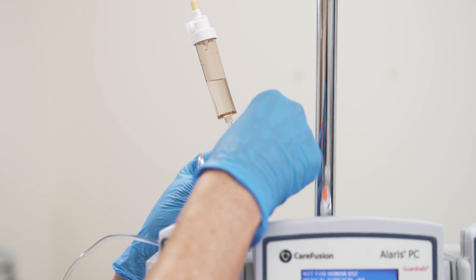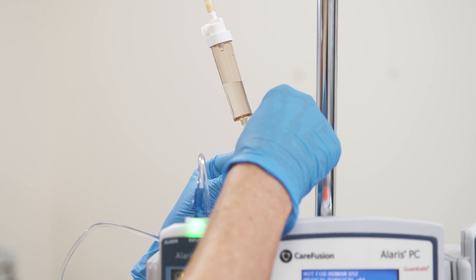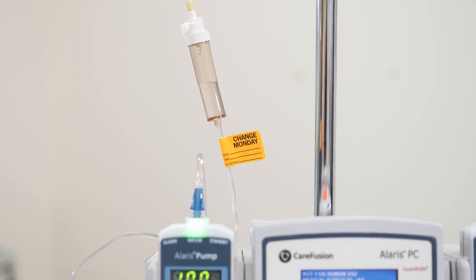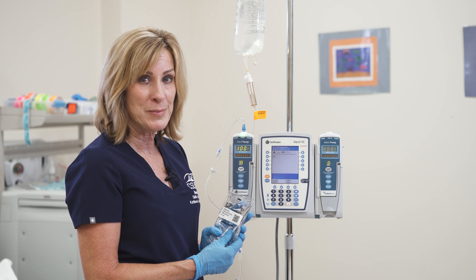Once we hang our tubing we're going to go ahead and label it so that future nurses taking care of the patient will know when to change the tubing. Every facility is different, but typically it's between 72 and 96 hours. Now I've got Cefazolin 2 grams that I'm going to hang.